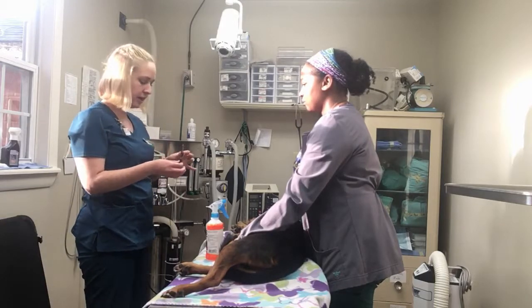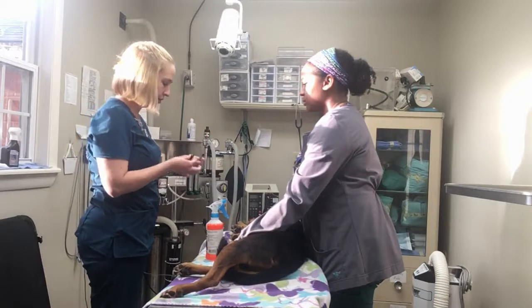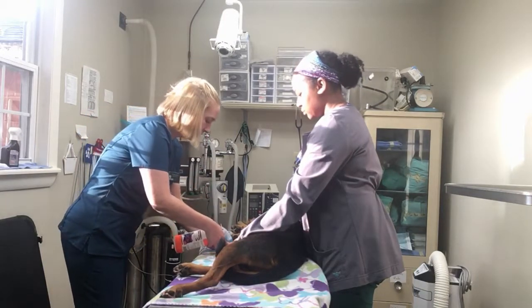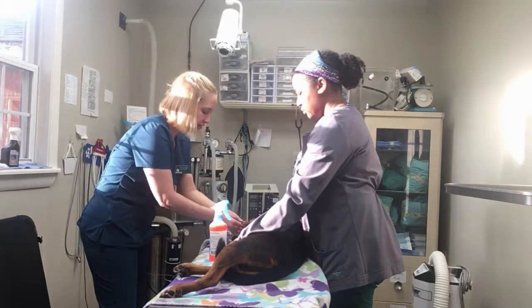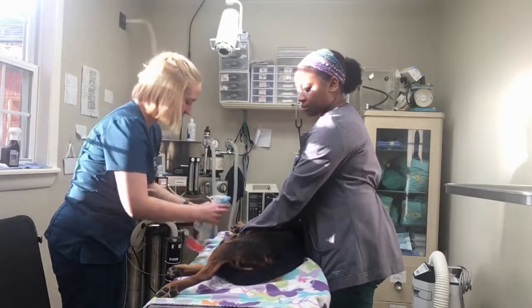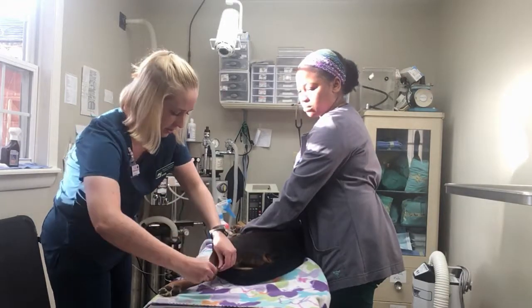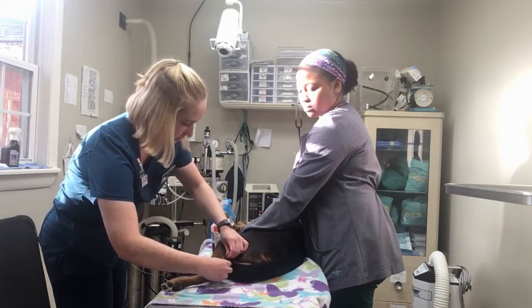A good trick to do is smoke over fire. So you're going to do the black lead on the front left, like I said, right underneath the elbow. And then you'll take the last one and put it on the left rear, right below the stifle.